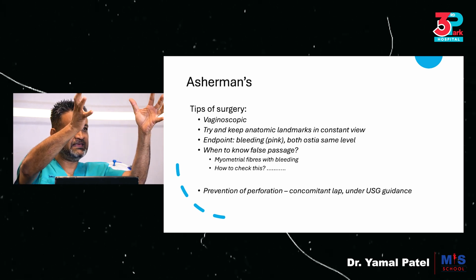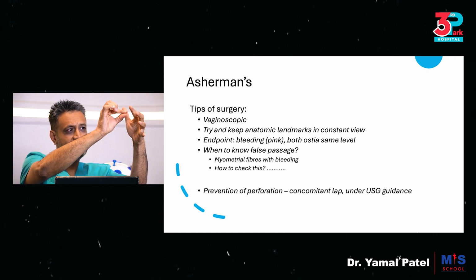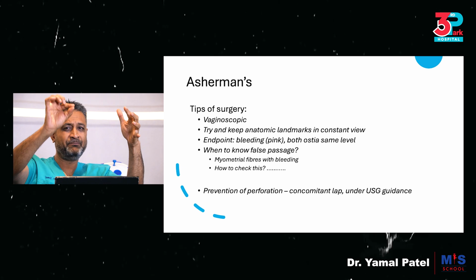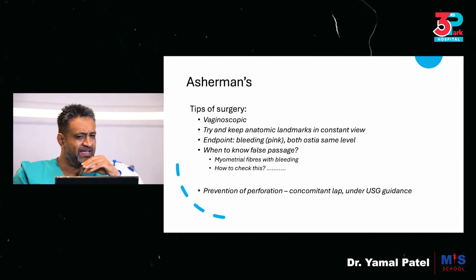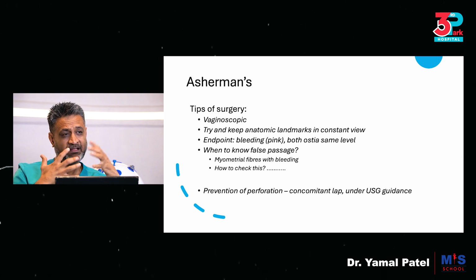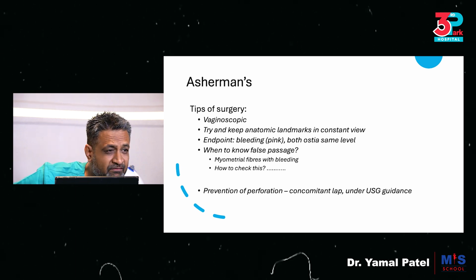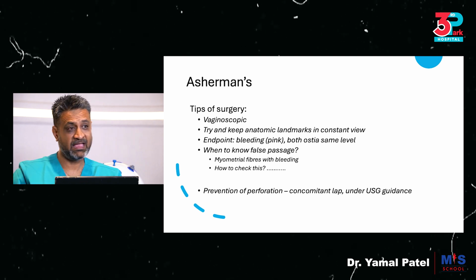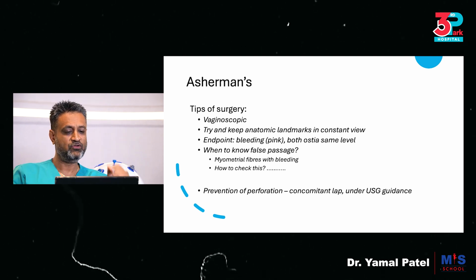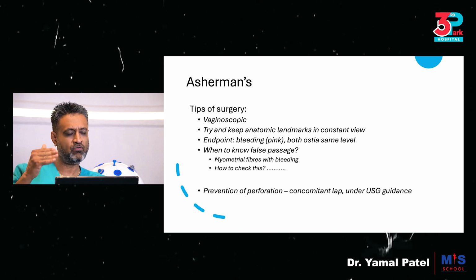So you will see the fluid inside now reducing, and you will see bleeding points that will start. So if there are a lot of bleeding points, and this area is just bleeding a lot, then please understand that you are in a place that's vascular, and it's unlikely to be synechia you're cutting. You might be in myometrial fibers. So be very clear on this, know how to check this.